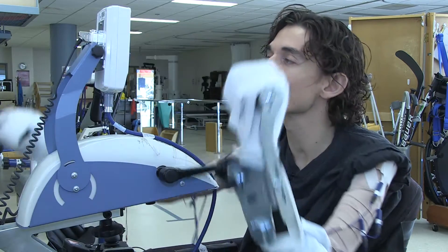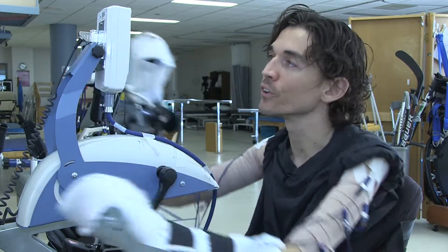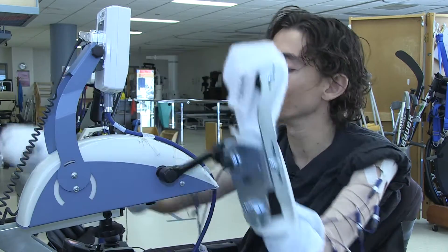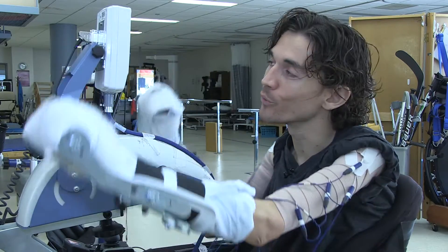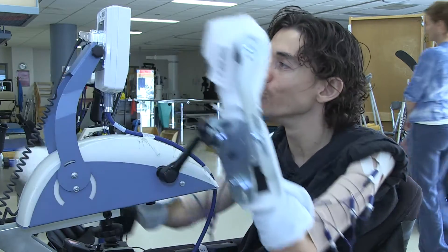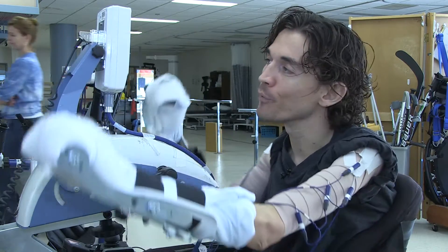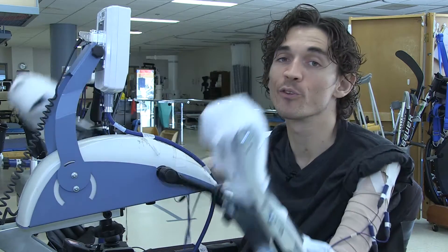This machine has certainly increased my ability to do various things around the house. It's exciting because it might be small increments and small things, but we'll just see where it goes from here.